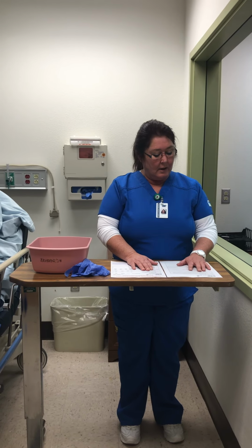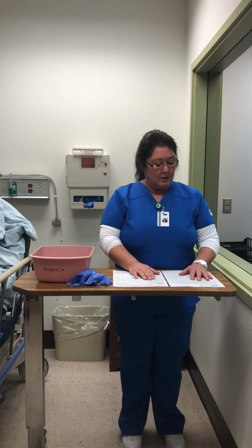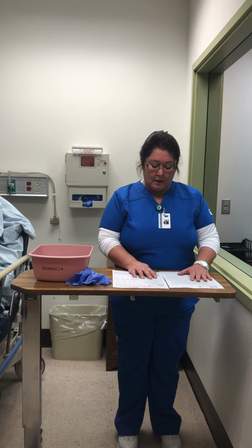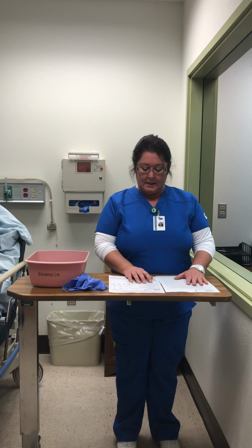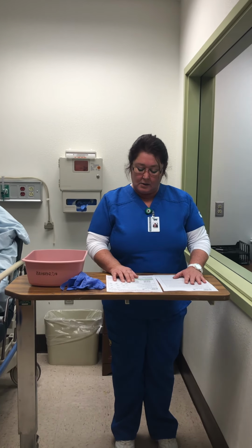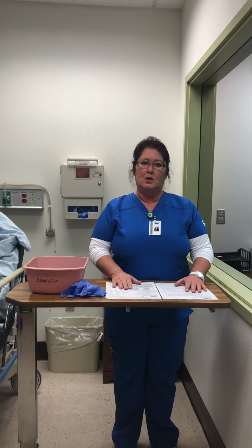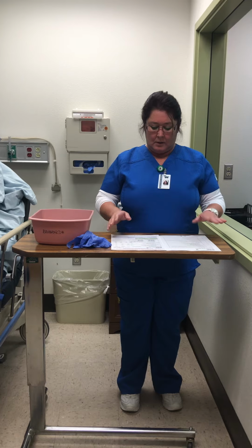I then have a Practi insulin Lispro U100 insulin pen with a mild sliding scale subcutaneously 3 times a day with meals. Over here I have the Practi insulin Lispro U100 insulin pen, and that is also to be given at 5:30, and that has a rapid onset of 5 to 15 minutes, so we'll want to make sure that her meal is actually in the room when we give this.